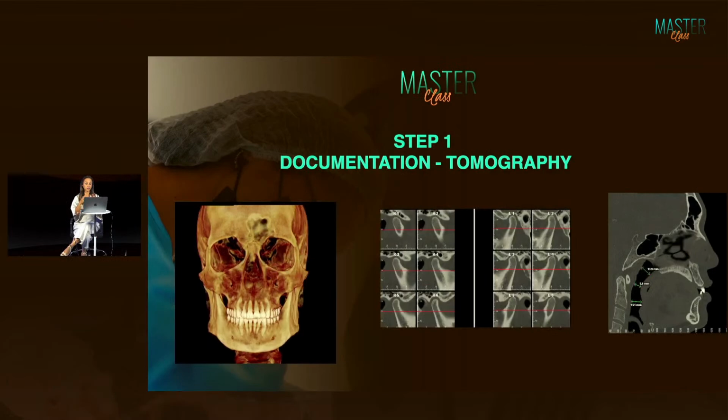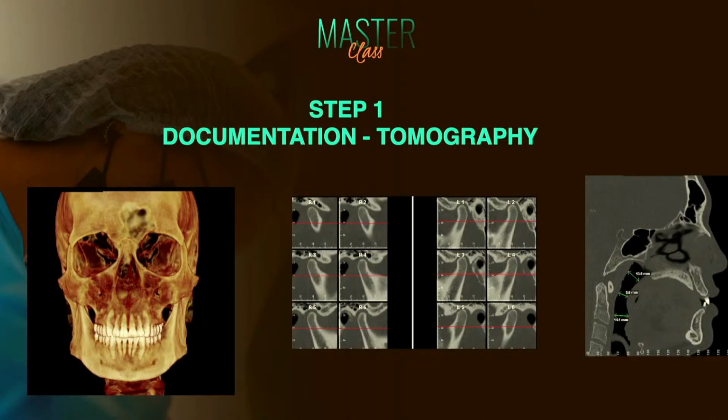Another thing that is important for the first consultation, in my opinion, is the tomography. Today, it's very common to have the tomography from the first consultation, and we can see the TMJs, the bone discrepancy, and all kinds of asymmetries, and we try to understand the difference and the proportion between the teeth and the bone. And I always do the 3D study of the airway of this patient. With the software, we study the skeletal problem of the patient in the first consultation, and I always do the 3D analysis of the airway.